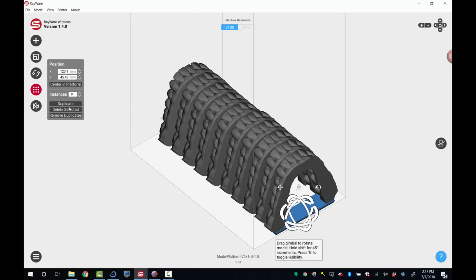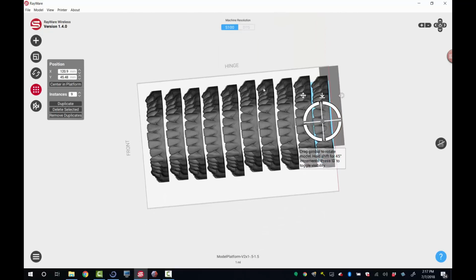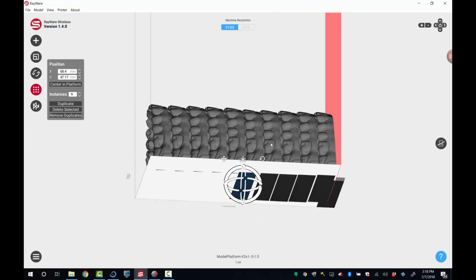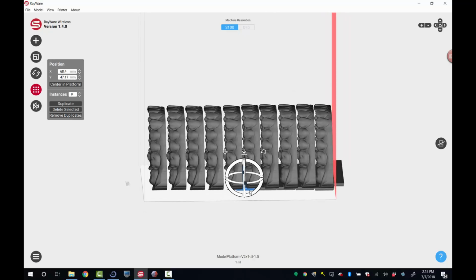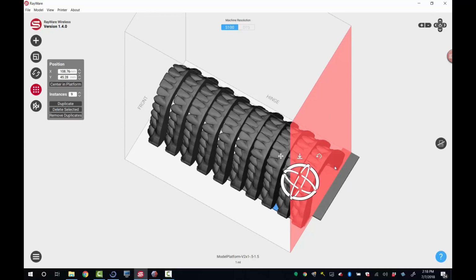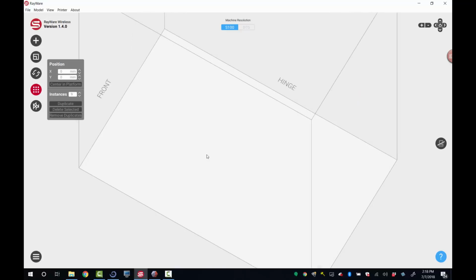Now I click on this, click duplicate. And so now I just need to bring these platforms up to each one as well. Okay, I'm not going to walk through the whole process of getting these all perfect. I'm sure you get the point, but we're getting all the models oriented on top of these platforms. So you can skip doing it in Mesh Mixer and just do it right in the print software. All right. So I'm going to go ahead and clear this. I'm going to move forward. I don't want to waste too much of your time on that.